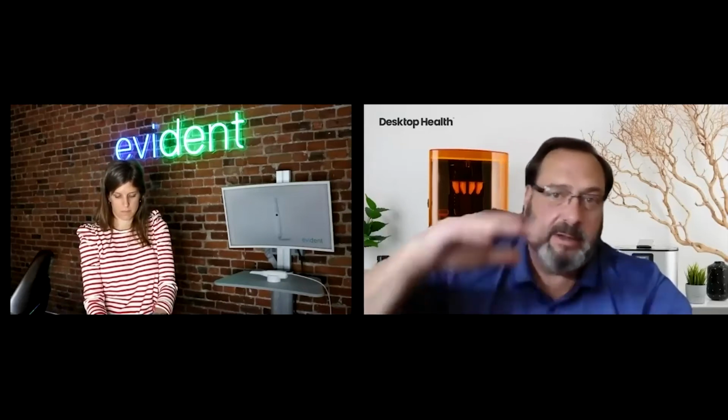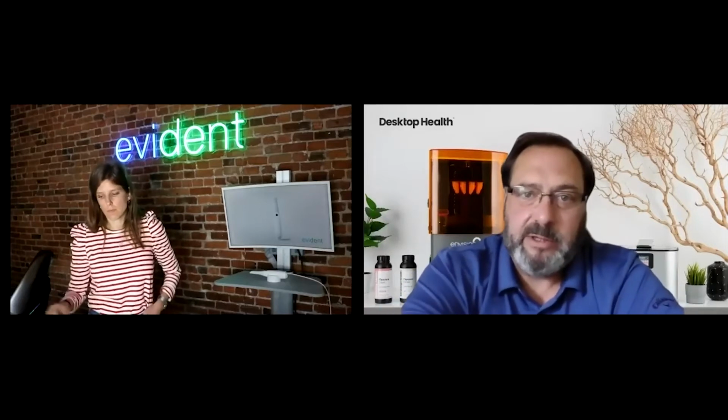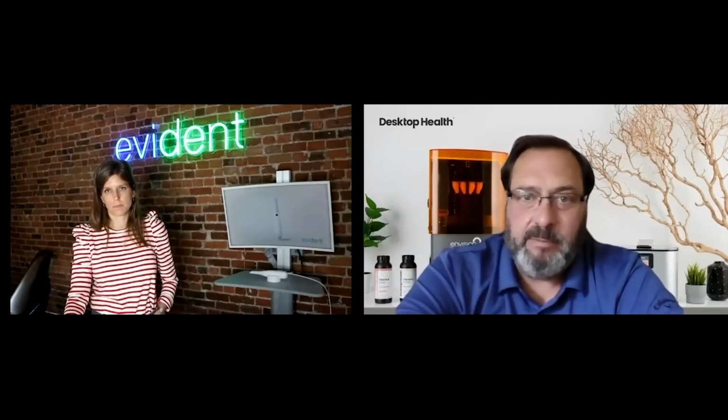But yes, you can design a denture depending on how fast you are. If you were doing it yourself, or you had a technician, you could take your exocad software and design that denture in about 20 minutes if you're good, and send it to the printer. It takes about an hour and a half to print the base in a vertical orientation, or a 45-degree orientation, and about 45 minutes for the Flexera Smile Arch for the teeth. Then they're cleaned and put together. So absolutely, you can do it in 24 hours.